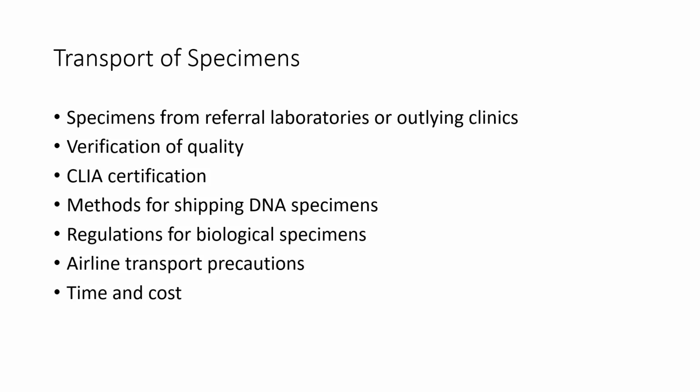So transport of specimens: specimens from referral laboratories or outlying clinics, verification of quality, CLIA certification. Also, CLIA regulates how specimens should be transported. There's different methods for shipping DNA specimens. There's regulations for biological specimens, airline transport precautions, and it all comes down to time and cost.